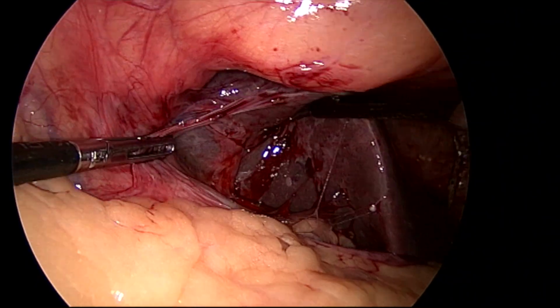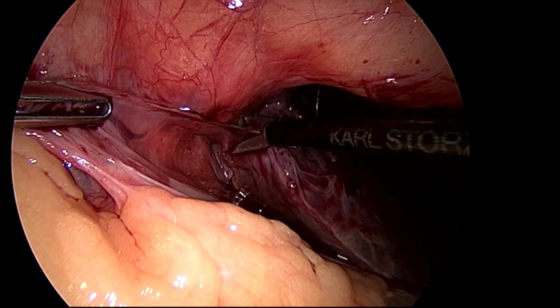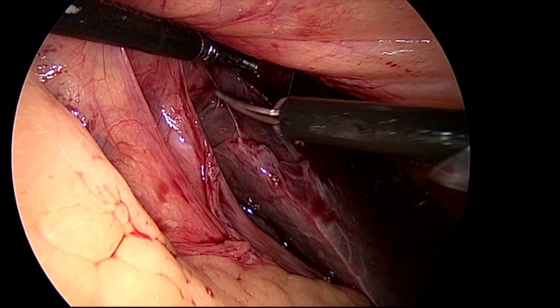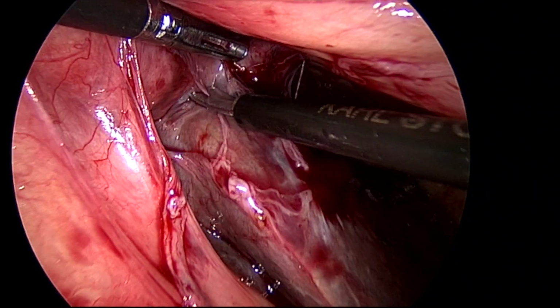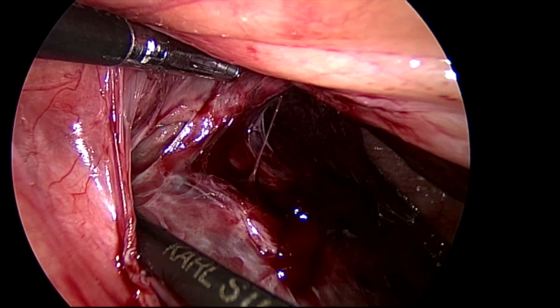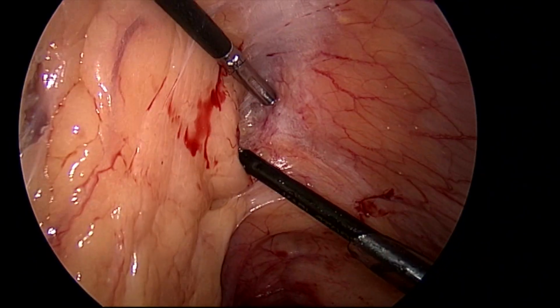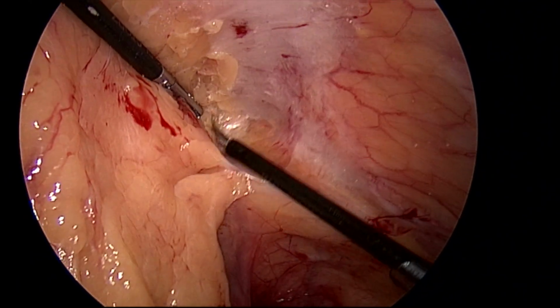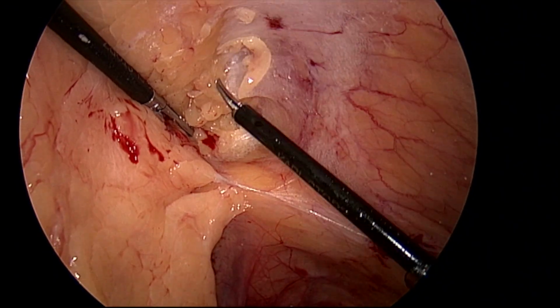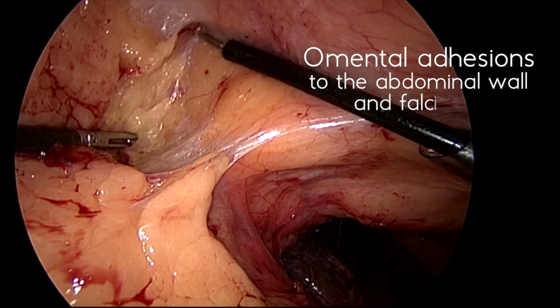So I put a camera in the infra-umbilical, and this scissor is coming from my right hand. It is on the left lumbar region, and the left hand, the bowel grasper, is coming from the right iliac fossa almost. So everything, including the camera, is on the left lower abdomen, and there are a lot of omental adhesions, so I'm not able to see the entire liver.